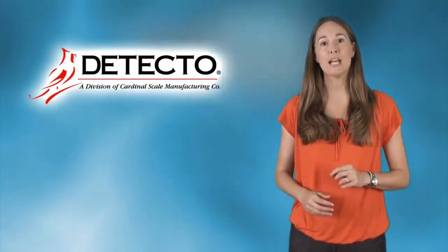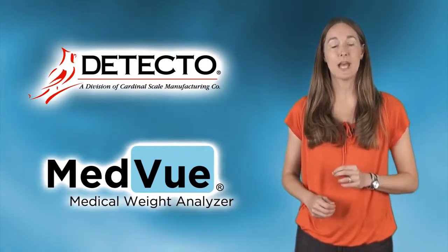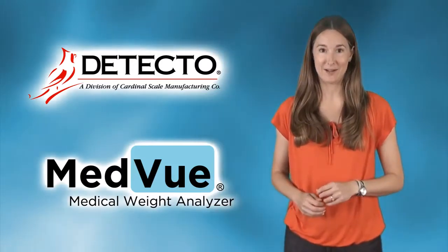This video will guide you through the easy process of replacing an obsolete Detecto Medical Indicator with the new MedVue Medical Weight Analyzer on a pre-existing scale.